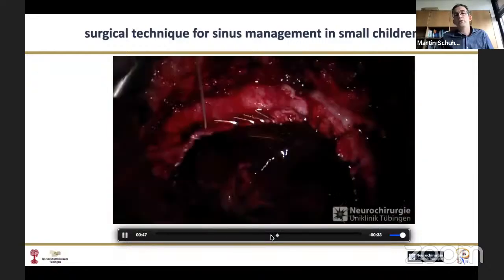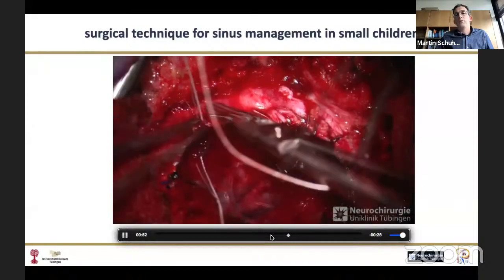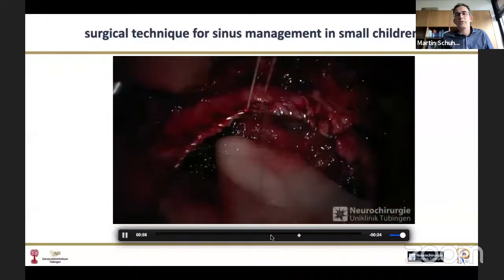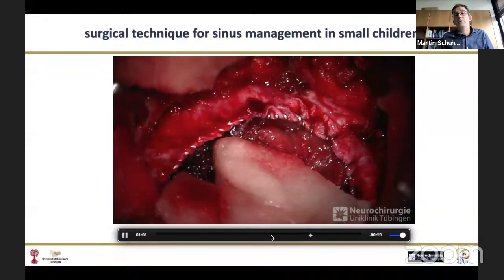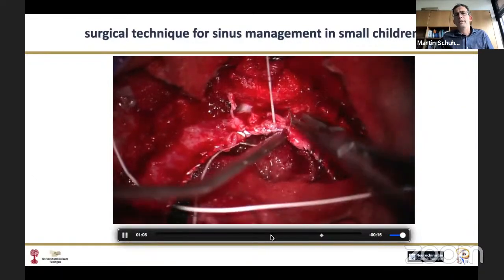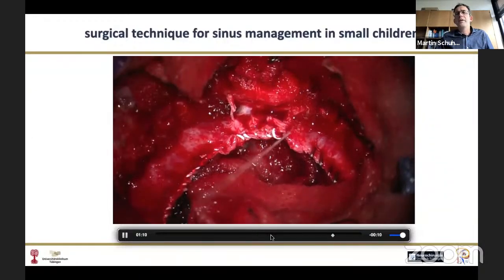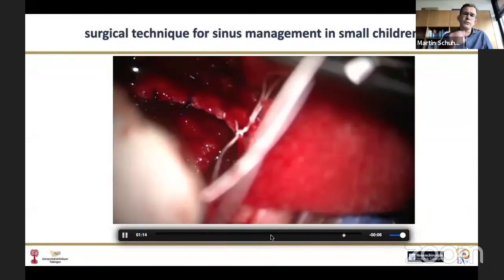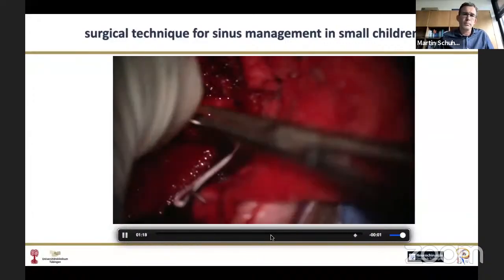And then you need to run a suture, because if you try to close that later on, one of those clips will come off, or it comes off during surgery, and you will have a catastrophic bleed in the posterior fossa. So we close this with an elastic suture. Here I'm using Gore-Tex suture, but you can use any monofil suture. And nevertheless, you can easily close the posterior fossa. So if you have to do these kind of sutures, we still can do a primary closure without duroplasty.